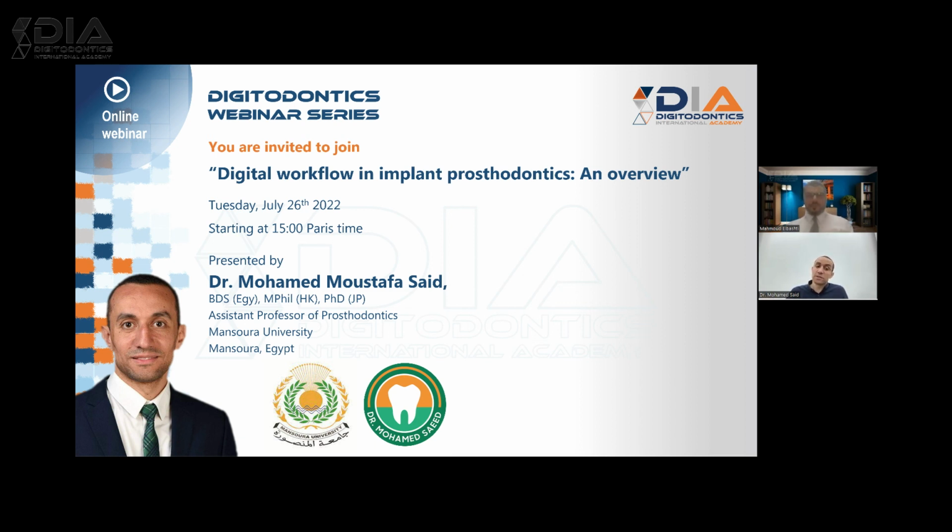And I can tell you that they provide us with software that we could use to plan and design a surgical guide with very high accuracy. So after merging the DICOM file with the STL file, we plan the surgical guide depending on the restoration, a prosthetic driven restoration.